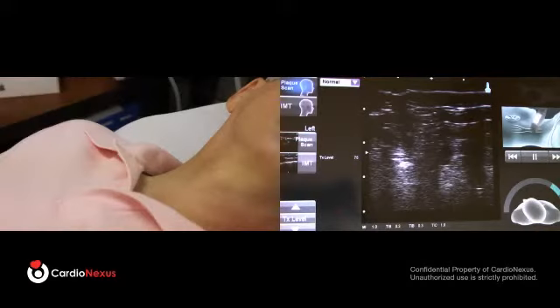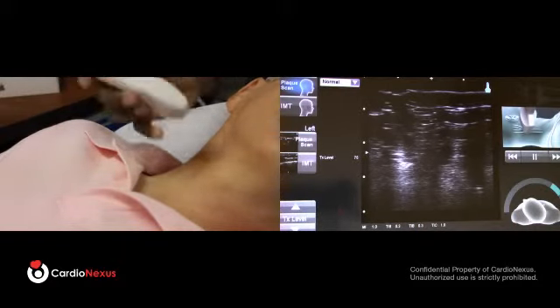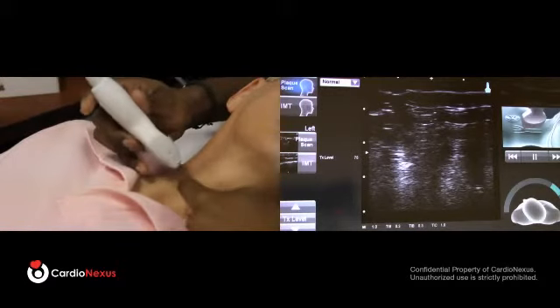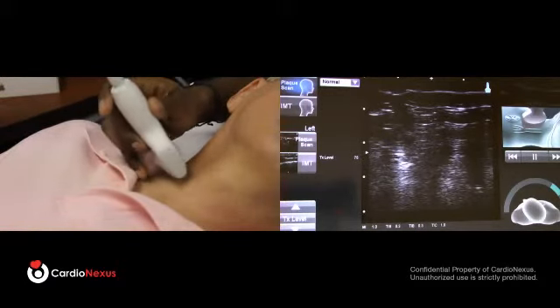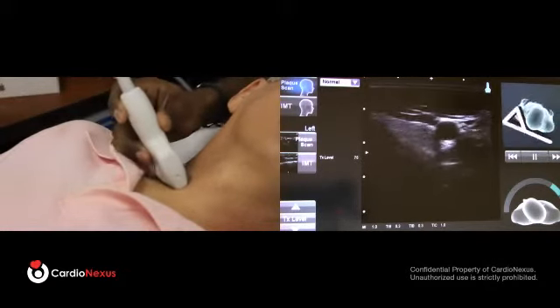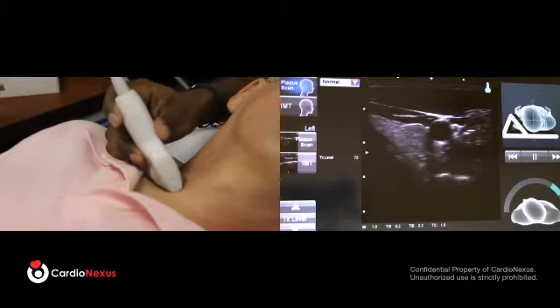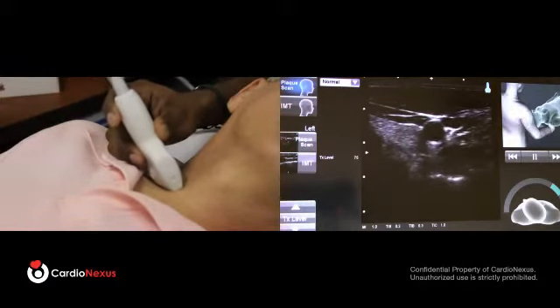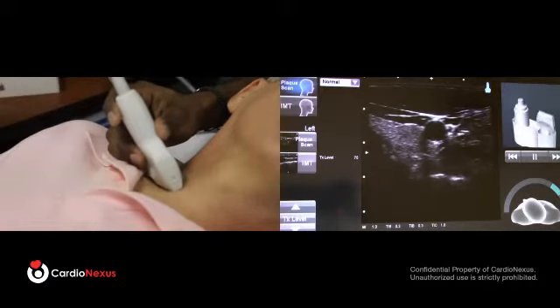So now we've repositioned the patient, moved the angle pillow to his left side, so we're scanning on his right side. Again, to locate a cross-sectional view of the artery, set the probe next to the center line of the artery, next to the thyroid cartilage, and then lay the probe flat. Again, you'll locate one dark pulsating circle, and that is the carotid artery.